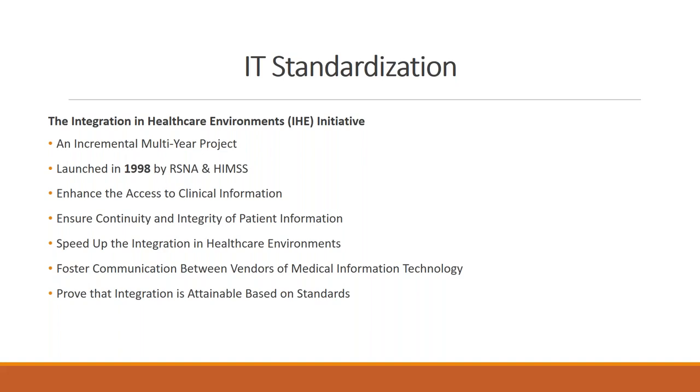So IHE came along, a very, very big project and still ongoing today. It's fostering that communication between vendors of medical information technology and proving that integration is attainable based on standards.